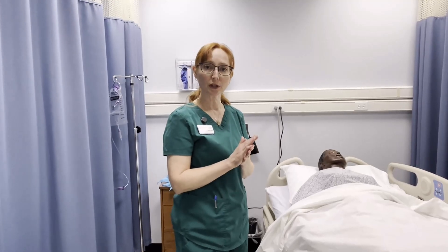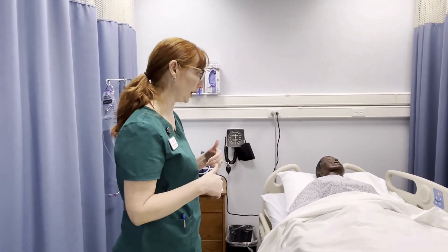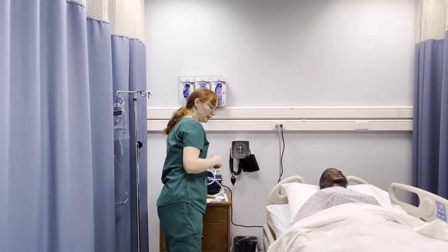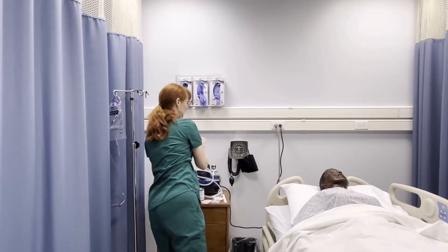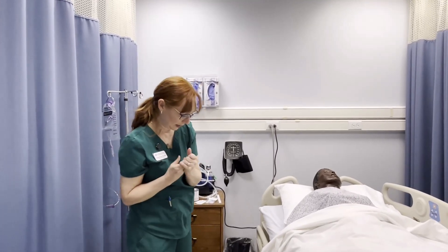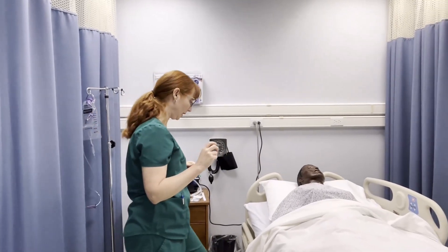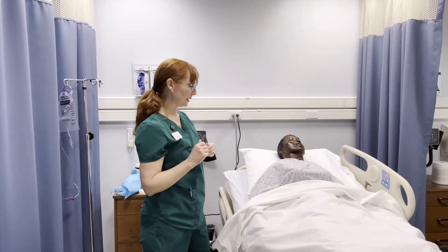We're going to do an insertion of an NG tube for nasogastric decompression. It isn't a skill you need to learn for checkoff, but I want you to be familiar with it because it is part of what you need to learn. I'm going to enter the room, do some hand hygiene. I already have the bed raised up and I'm going to have the patient in an upright position for this procedure — sit up as high as they can.